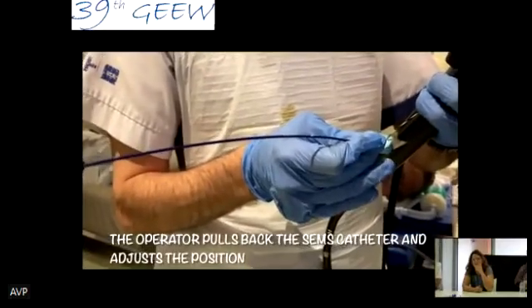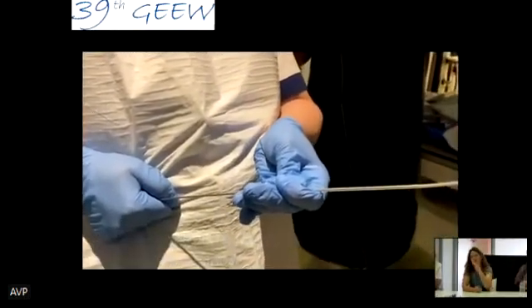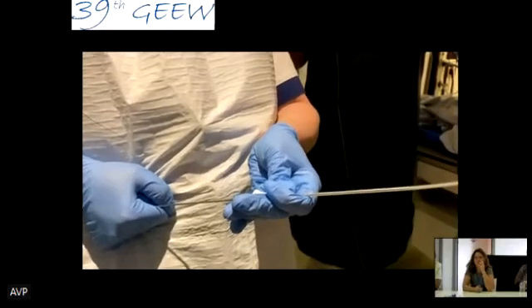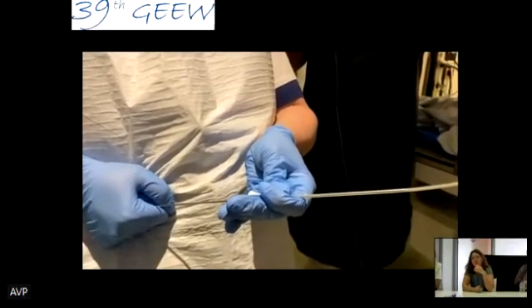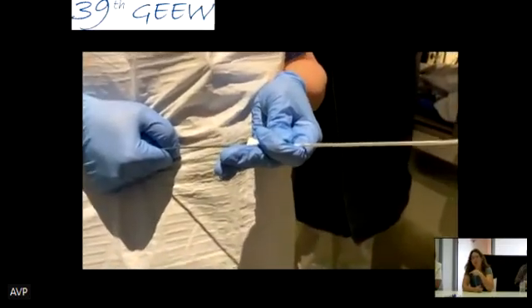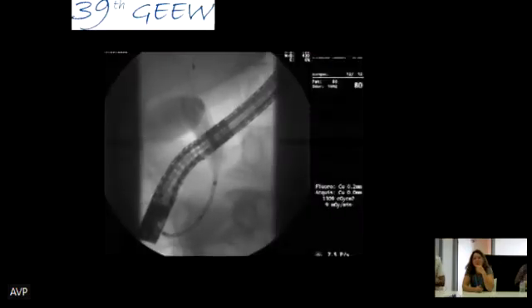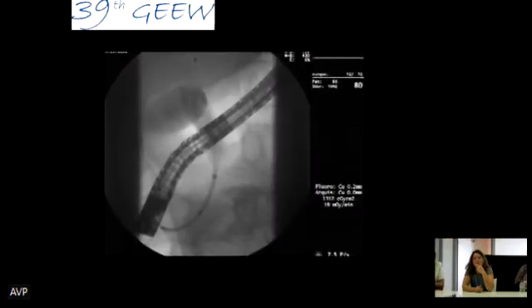And also there's the important manipulation of adjusting the stent, because when we do this, the stent goes upwards, so the operator has to bring it back to keep it at the same position, and he is guided by the mesh and the end of the stent, the markings inside, what he sees inside on the endoscopy. So here we're reaching the point of no return.